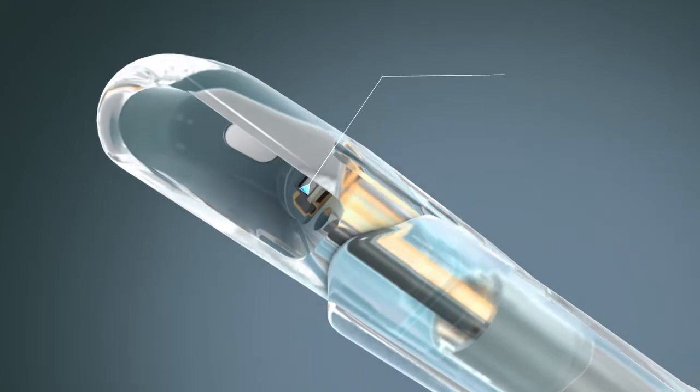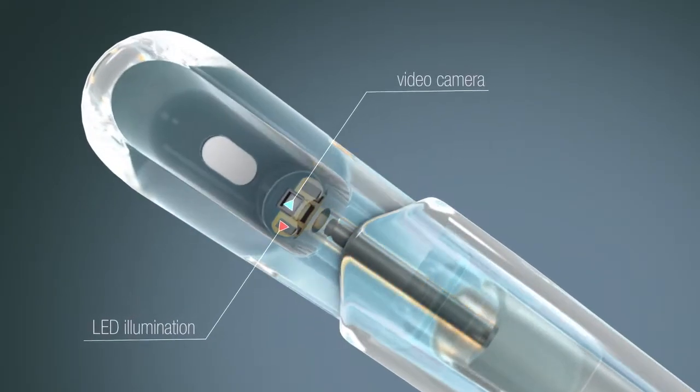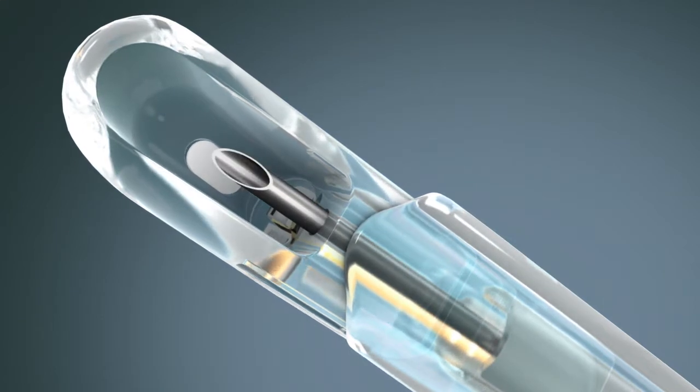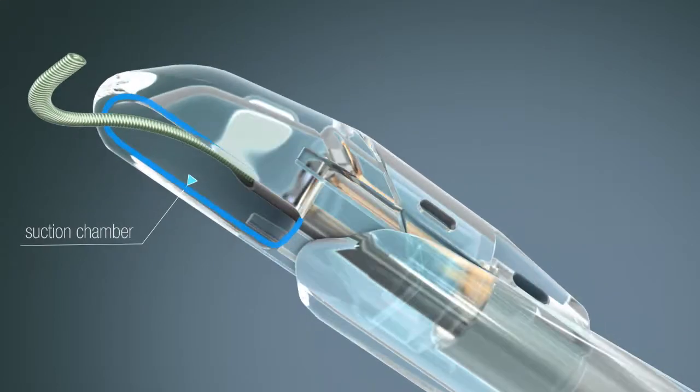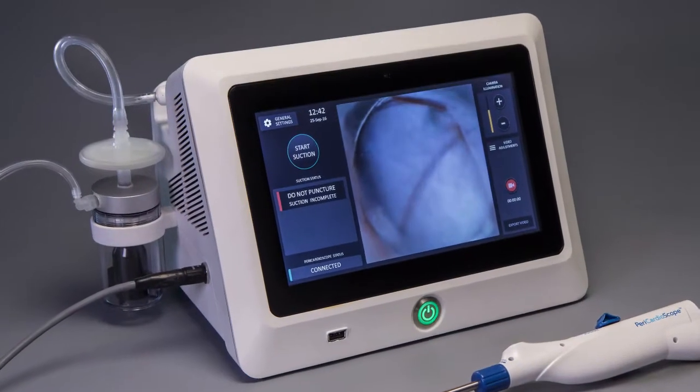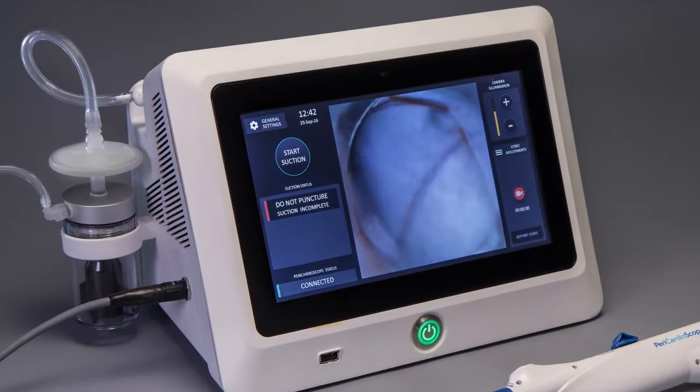A video camera helps the surgeon identify tissues and keep on track. Safe entry to the pericardium is achieved with a suction chamber so that the needle always remains within the device. A console supports the pericardioscope and displays the video.